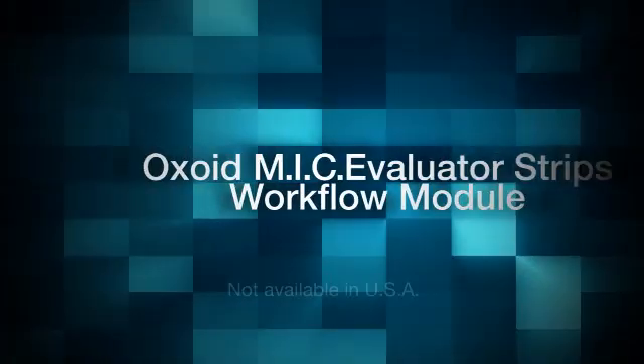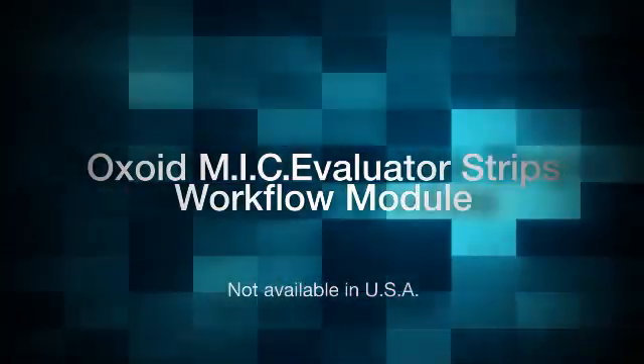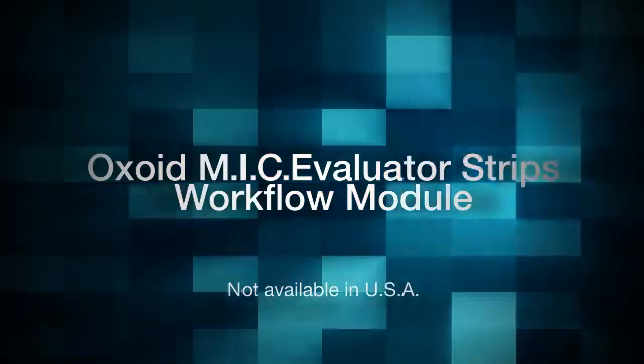Thermo Scientific MIC strips combine the ease of use of a diffusion test with the accuracy of an MIC and the flexibility of a manual system for simple, reliable testing.